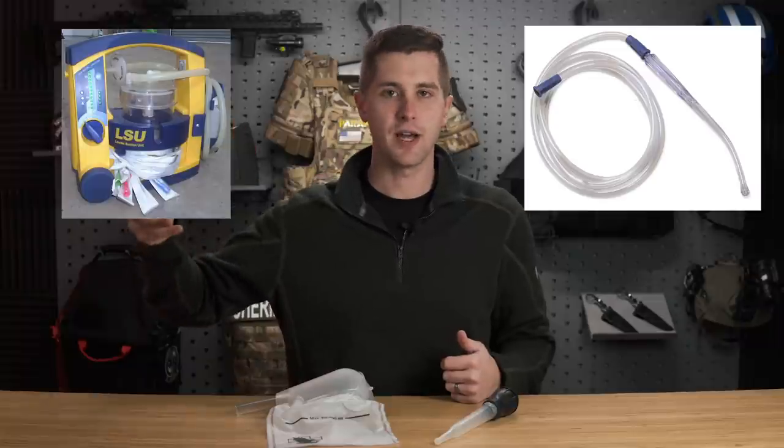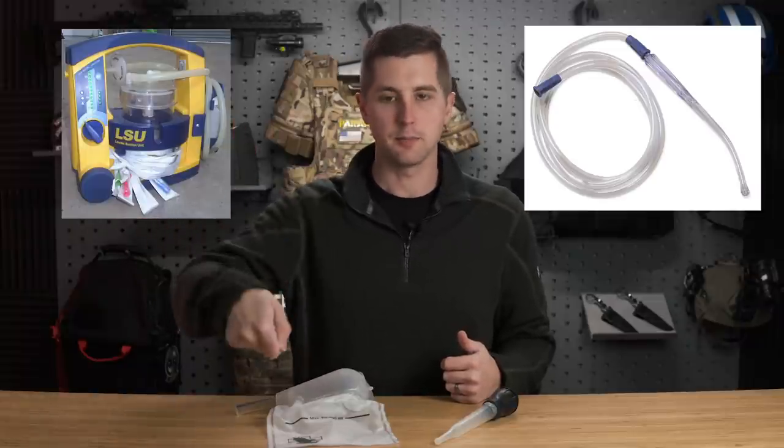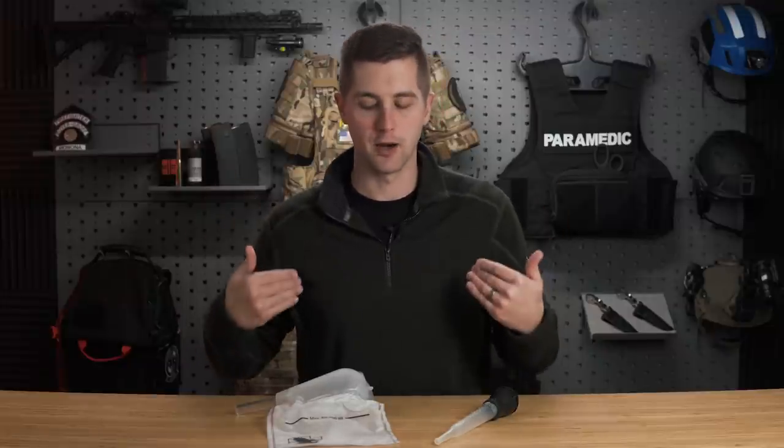We can do that a multitude of different ways. On an ambulance, we have electronic suction with a decanto tip or a yankauer tip, which allows us to turn on continual vacuum in the ambulance, take that, put it in the patient's mouth, and get most everything out of there and clear that airway.